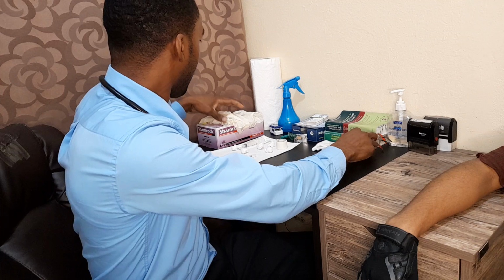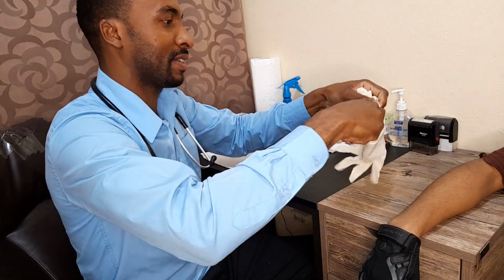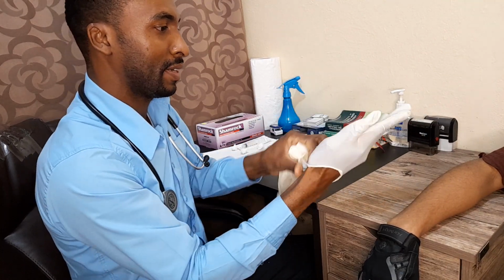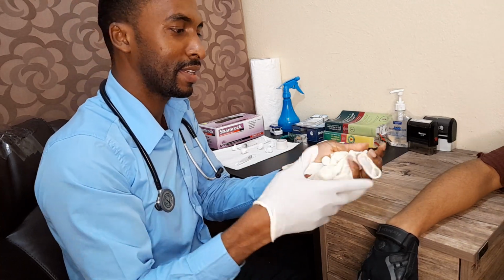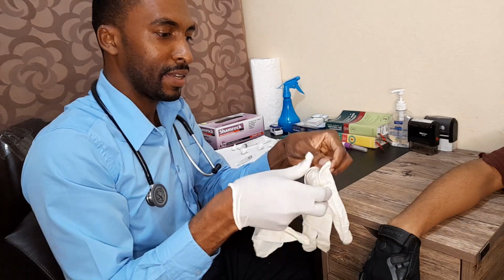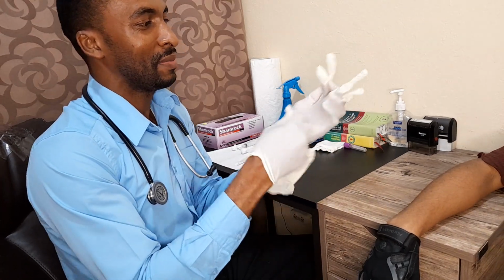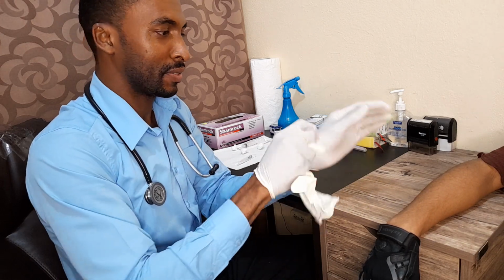So to demonstrate, this is mainly about blood taking and not necessarily about the theory behind what it's used for. It's basically a technique I want to demonstrate to medical students who are probably in their third year rotation, or even nursing students who may be wanting to know the technique which we use to take blood.